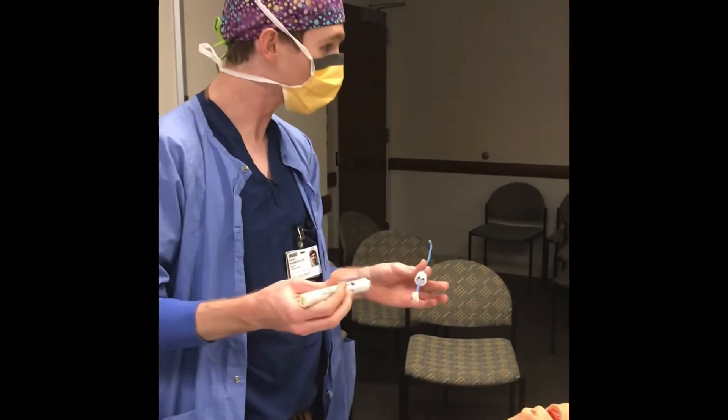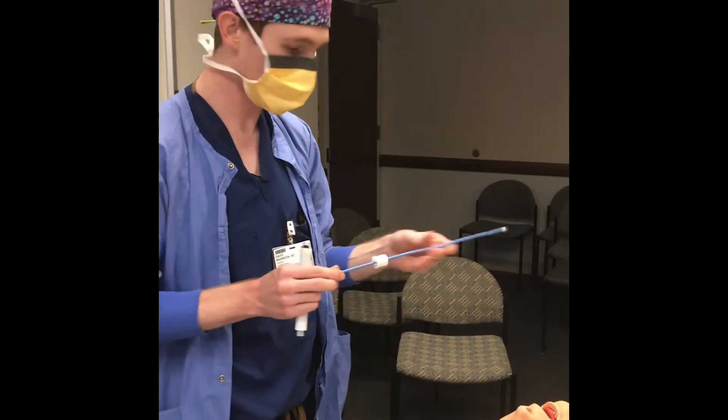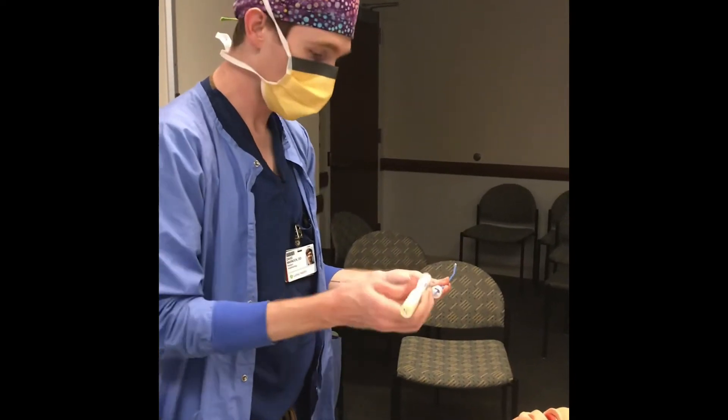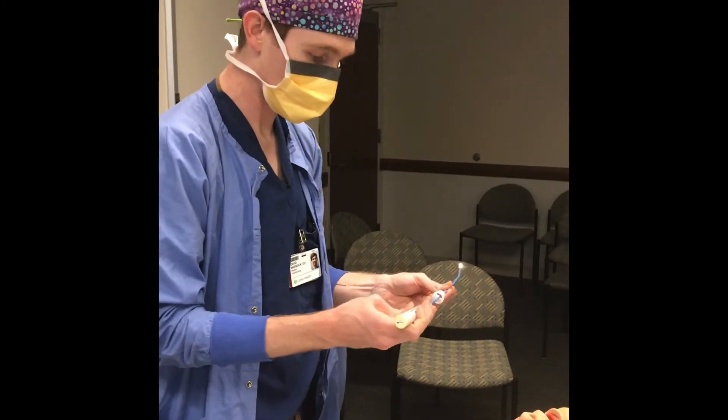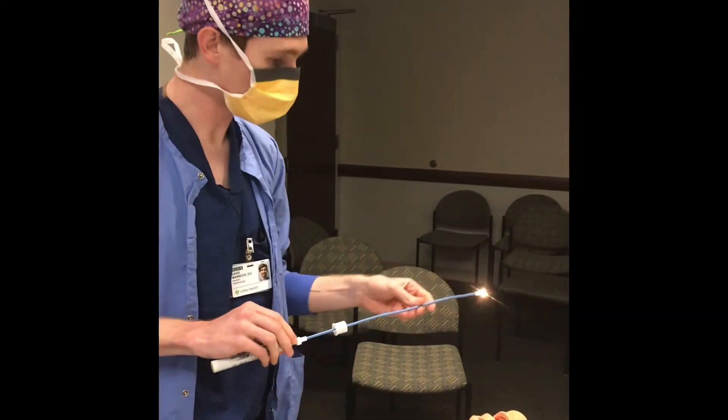The light wand comes in two pieces separate from the endotracheal tube — you have the stylet itself as well as the light wand. You connect and plug it in; there's a little clip so you know which way it goes, and then it lights up at the end.